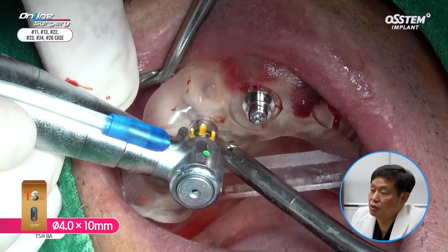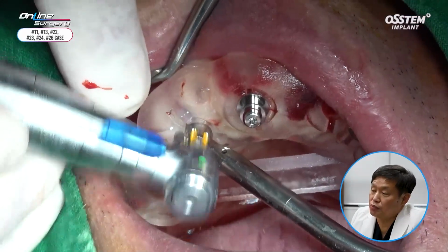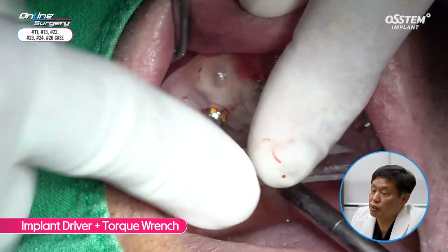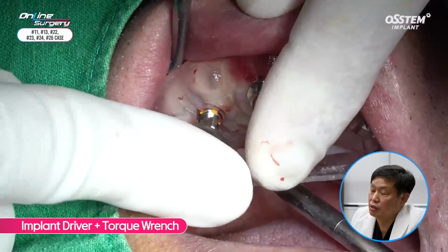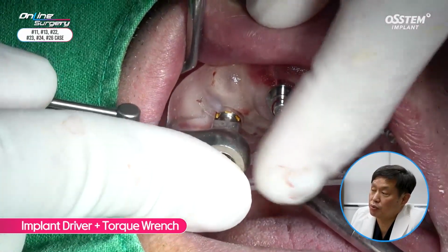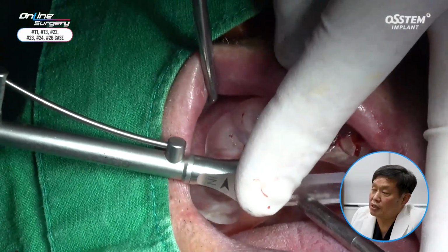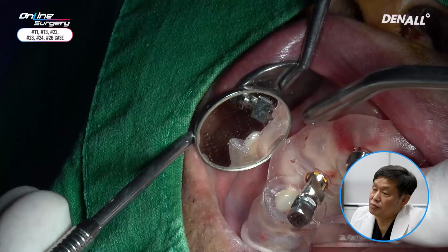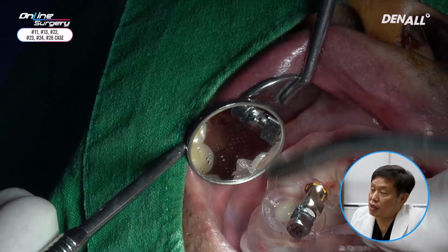Saline was applied in number 13 as 4.0 by 10 mm implant was placed. Implant driver and torque wrench was used to adjust depth and hex positioning. Primary stability was over 30 Newton centimeters. Number 13, position was checked.